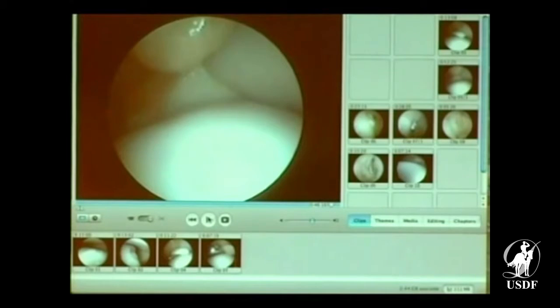A lot of the OCD stuff that you've talked about over the years, we don't talk about it as much in dressage horses because the Dutch and the Germans radiograph all the horses as youngsters and they take the fragments out, and that's a good thing. I'm not saying that's a bad thing or they're covering anything up. It's a good thing. It's the same thing that I'm going to do next month with the racehorses in Southern California: we go through all the yearlings and x-ray them looking for fragments because we'll fix them before they become racehorses. The Germans and the Dutch fix the horses before they come over.